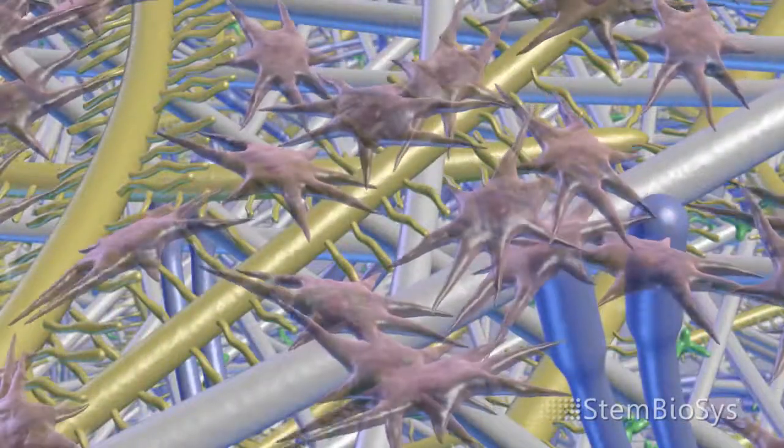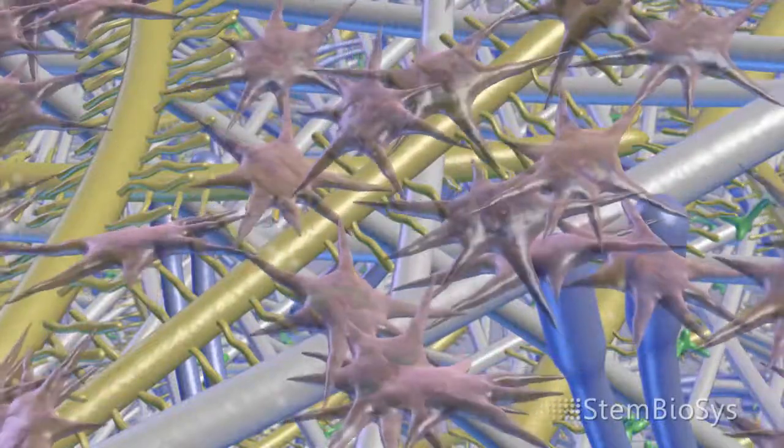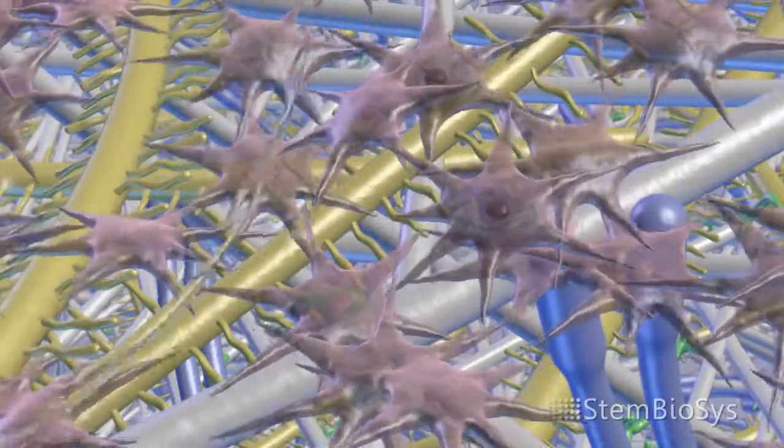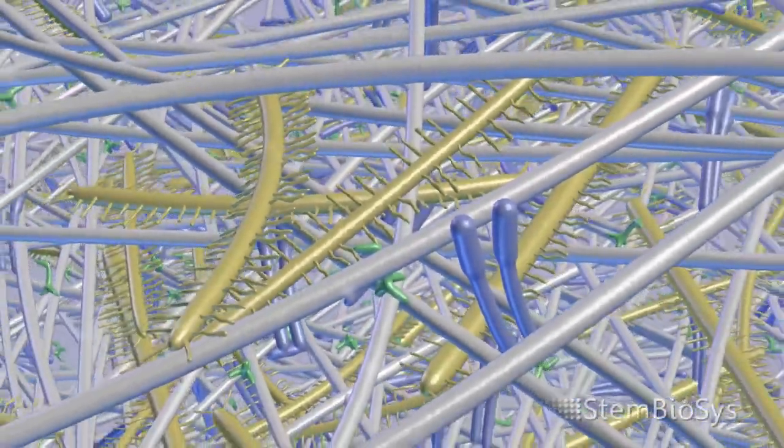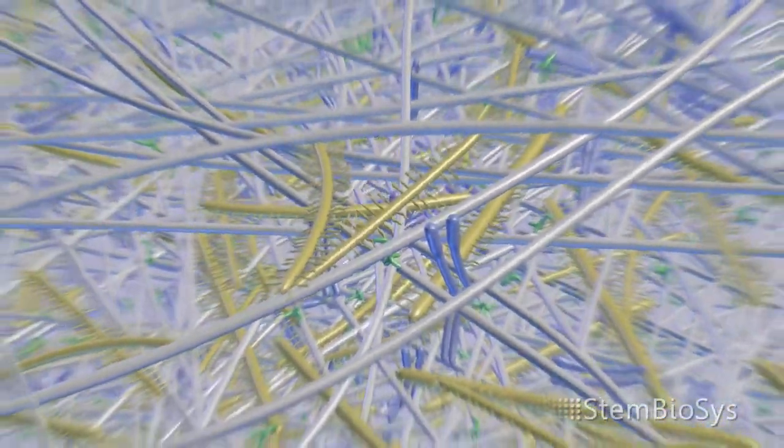Following production of their extracellular matrix, the remaining bone marrow stromal cells are removed very gently, so as not to change the architecture or the biochemistry produced by the cells.